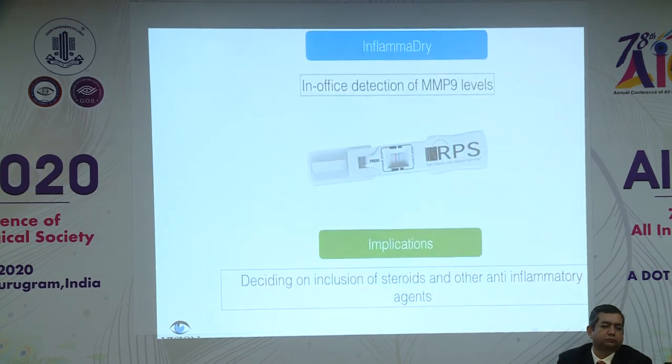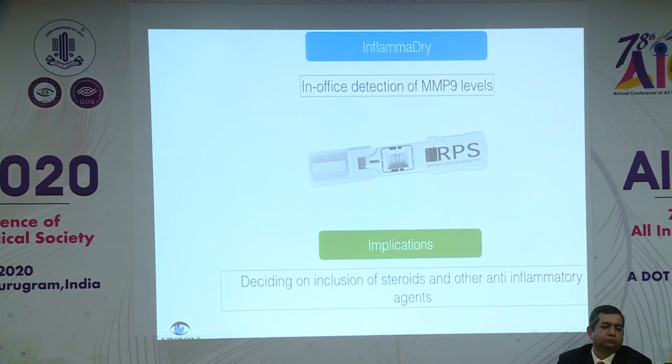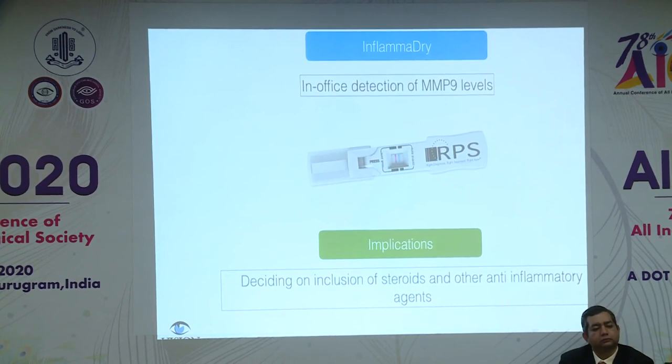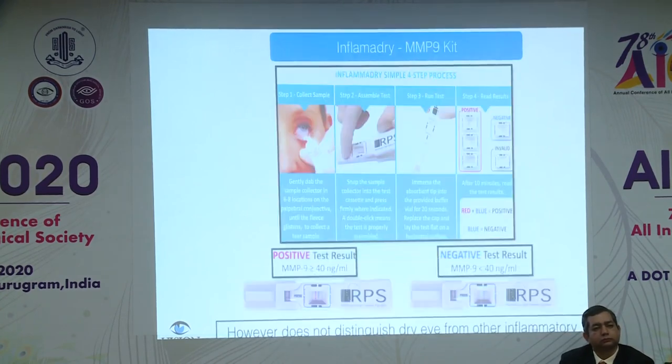Another important tool is the InflammaDry, which basically measures the MMP-9 levels in the tear film. So what this is going to tell you is if there is inflammation in the eye. Based on that, you can decide if you would like to include steroids or other anti-inflammatory medication in your regime. Again, the disadvantage of this is that it's not going to tell you if the inflammation is because of dry eye. It'll tell you there is inflammation. That inflammation could be because of VKC, could also be because of infective conjunctivitis or any other thing. So you have to diagnose dry eye on your own, not with this.